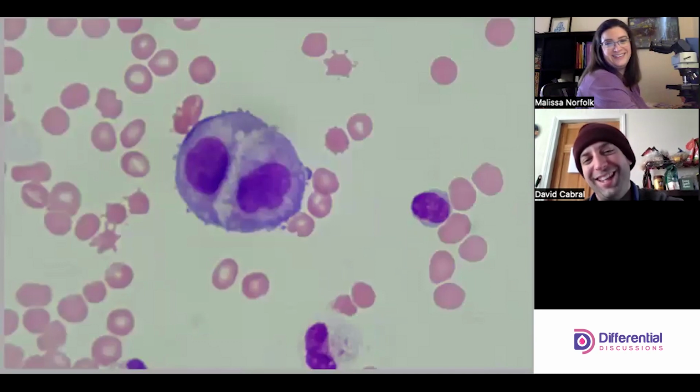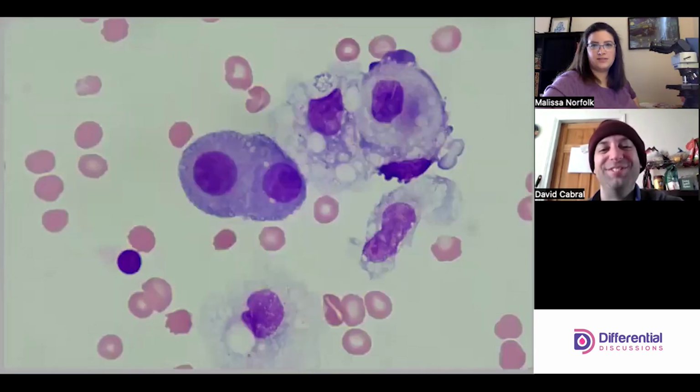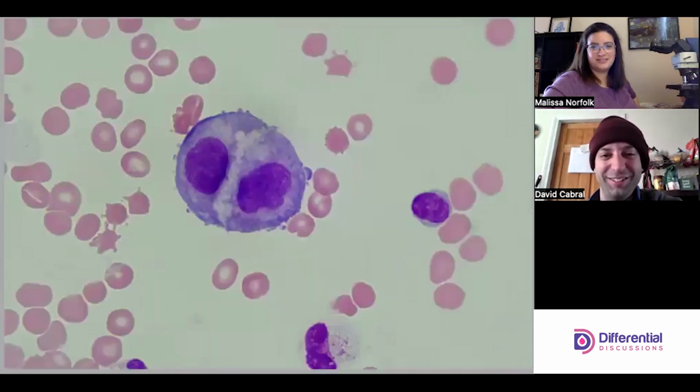And then that reinforces, right? This is ugly. Let's just say normal, versus this, not normal.